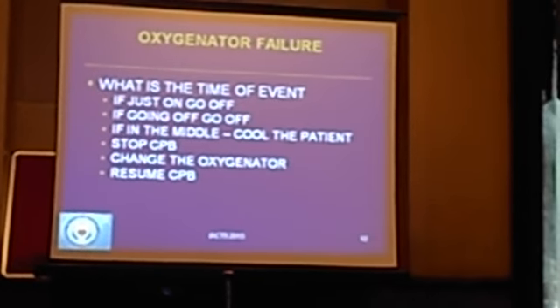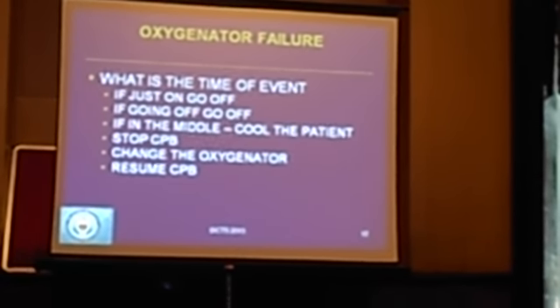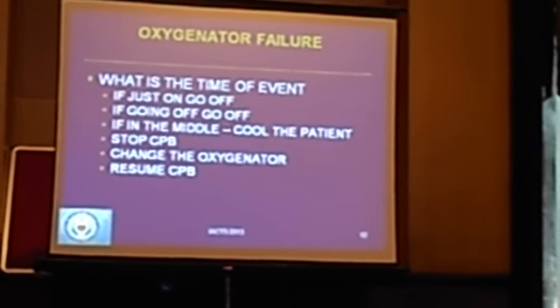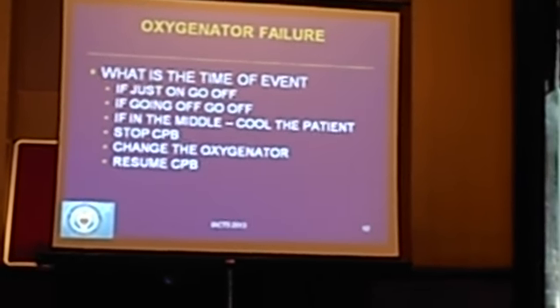This is something which you actually have to practice. Perfusionists have to practice. If I say that you change the oxygenator, what will he do? You know what he will do if you have to change the oxygenator?